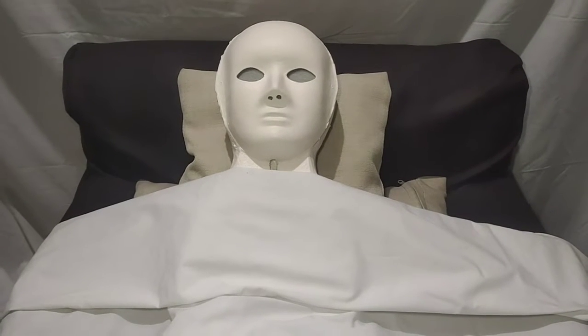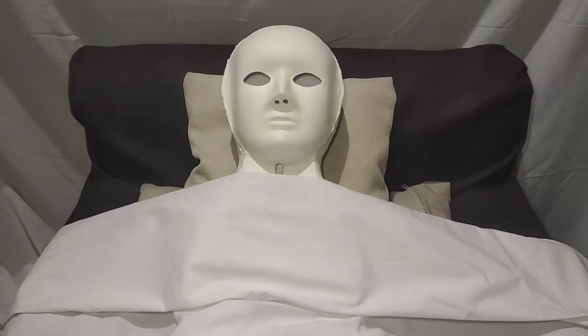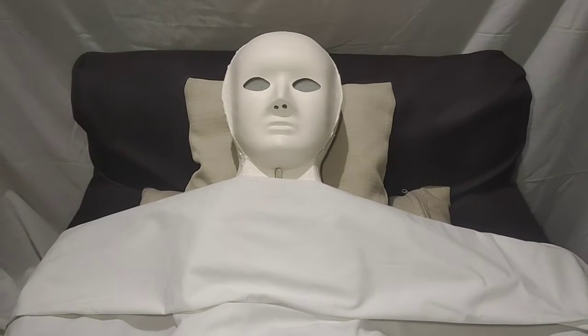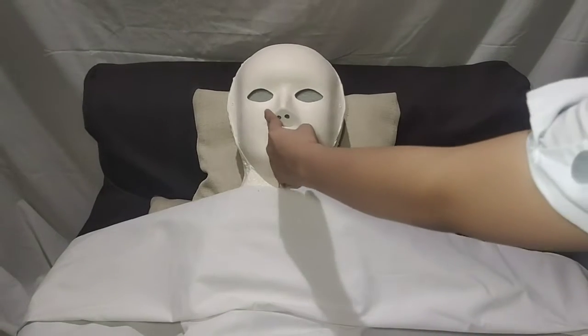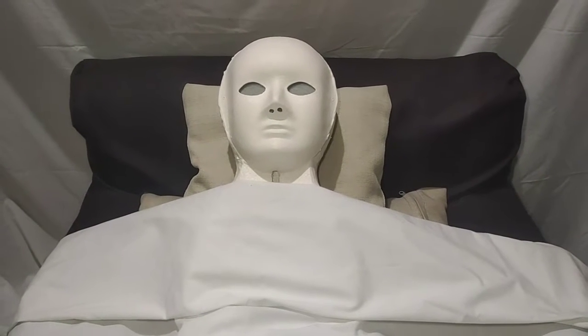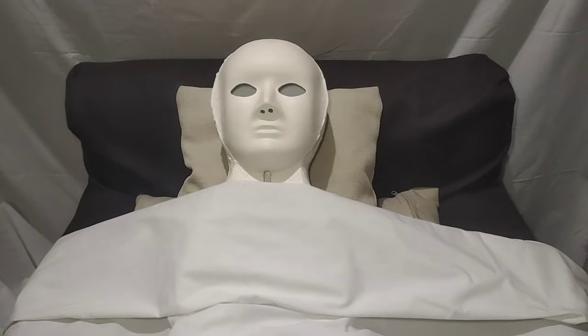Select the nostril through which air passes more easily. Good afternoon, ma'am. I am your nurse for today and you are here for the nasogastric tube insertion procedure. Ma'am, can I ask you to occlude one nostril? Occluding the nostril will tell us if there is an obstruction to the passing of air. The right nostril is the side where air passes easily.